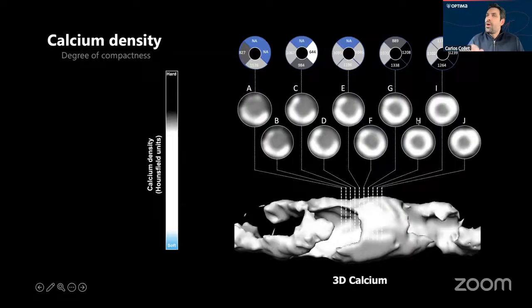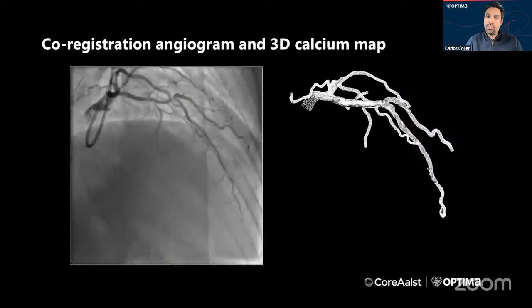So using the quantification of density, we have understood that most of this circumferential ring of calcium is not homogeneous calcification. It depends, of course, on the patient, and in my view on the age of the calcification, but you'll see here that this is most likely to be heterogeneous.